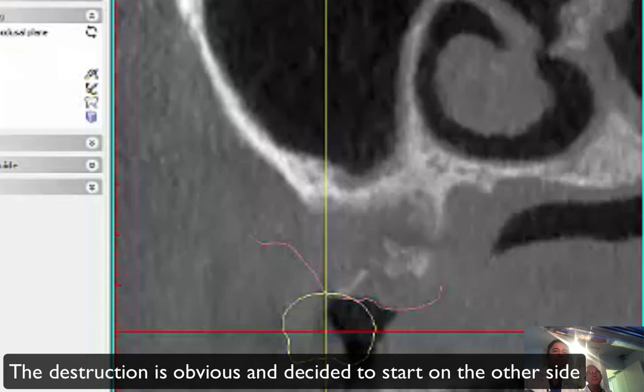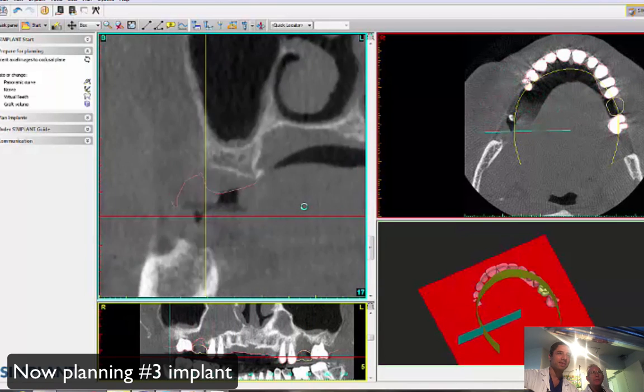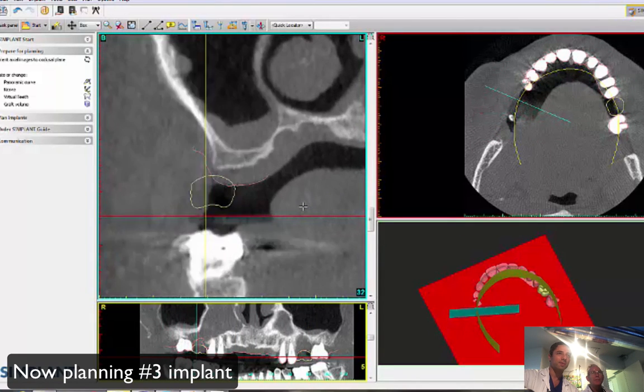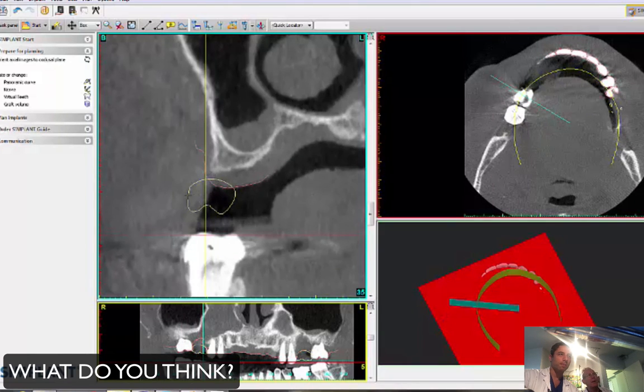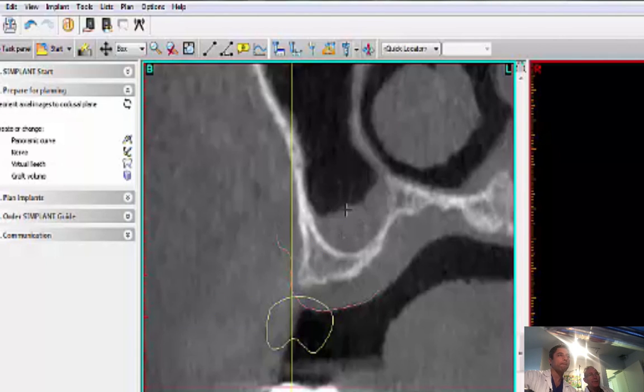Okay, let's start with number 3. What do you think about this cross-section on number 3? I think we don't have a lot of bone, and the membrane is kind of thick.